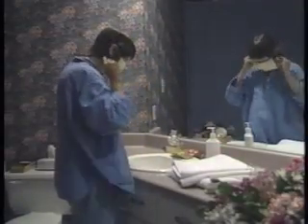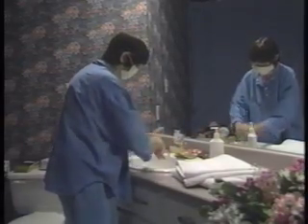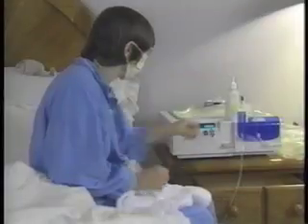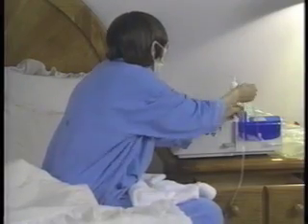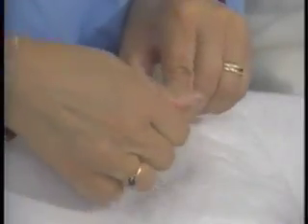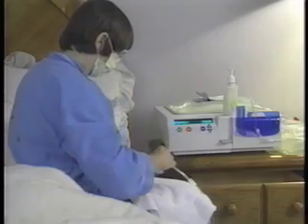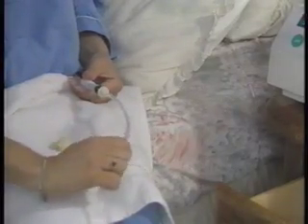To reconnect, mask and wash your hands to minimize any risk of infection. Remove the disconnect cap from the patient line, leaving the line in the organizer. Remove the mini cap from your catheter. Remove the patient line from the organizer and connect it to the catheter. Open the clamps to the catheter and patient line, then press the go button. The machine will continue your therapy from where it left off.